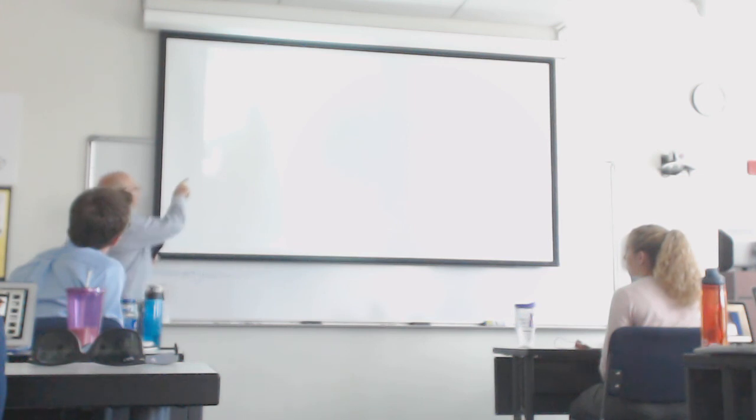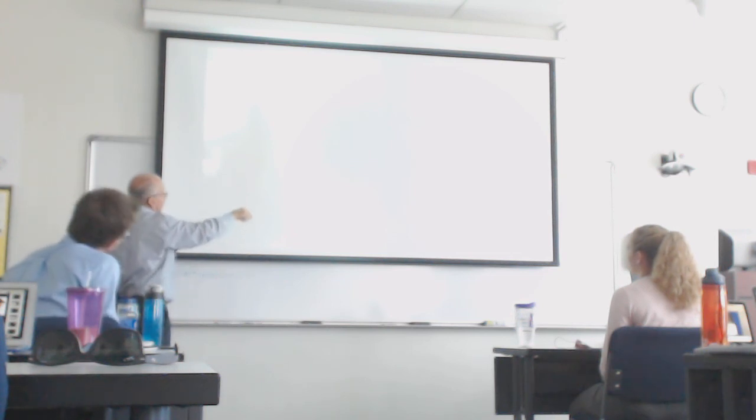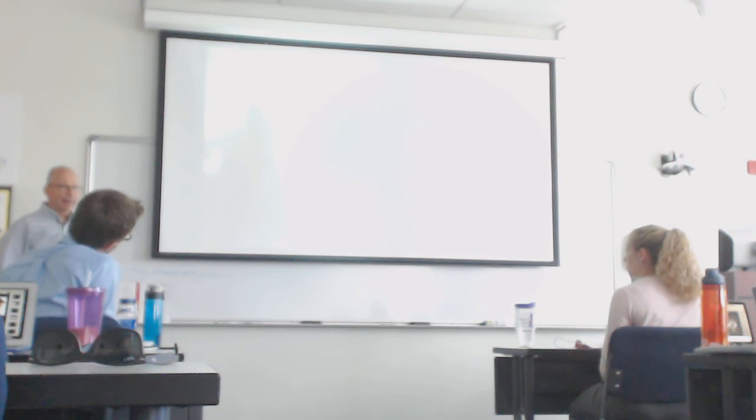We're almost done. Body of C1 is that, this lip right here. 2, 3, 4, 5, 6, 7. I can see all of 7. I'm good. That's a perfect lateral C-spine.